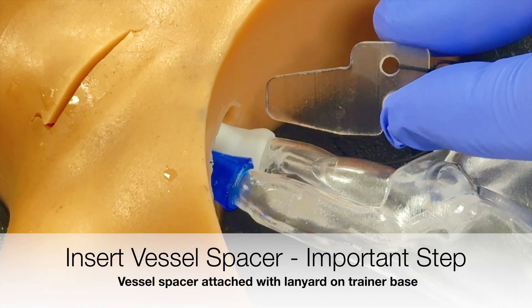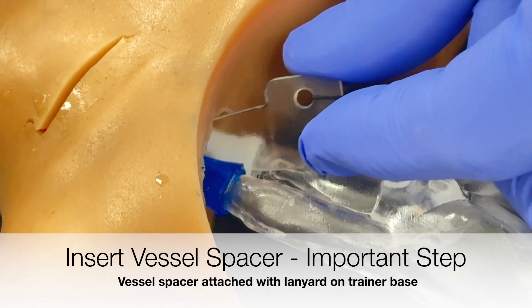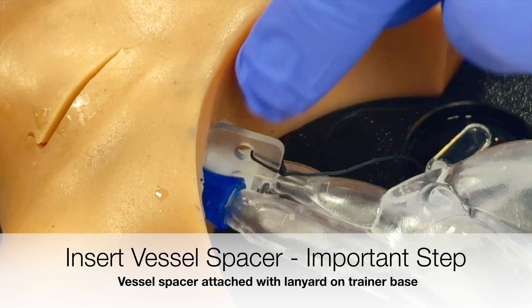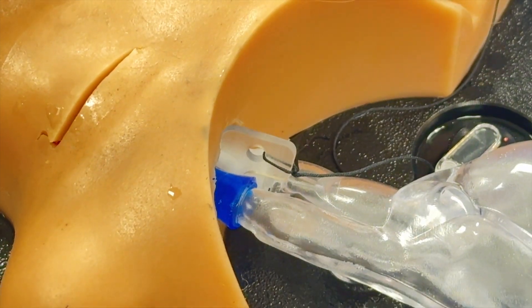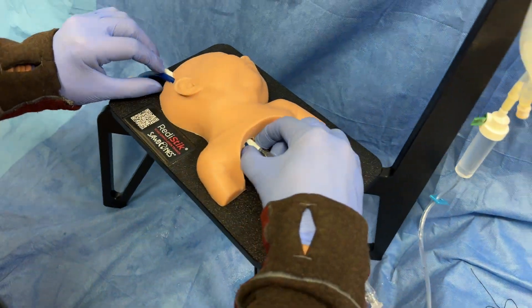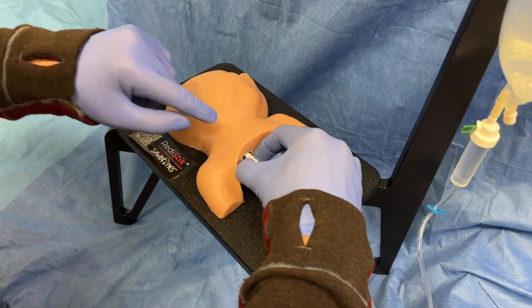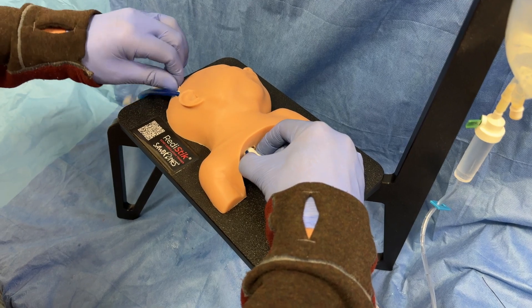The next step is to insert the vessel spacer in between the internal jugular vein and carotid artery. The vessel spacer is connected with a lanyard to the base. This is an important step — do not skip it. Then give it one more gentle tug to make sure it's not crossed up or gapped up inside the neck.